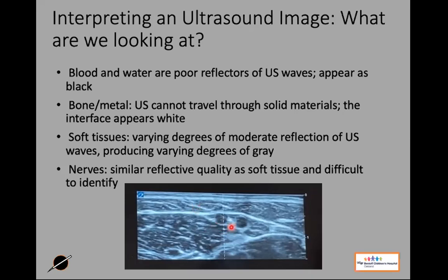And if we see two blood vessels running together, you can see this kind of compartment here. There's kind of a triangular compartment here. That's a great place for that triad that I was talking about earlier, the artery, the vein, and the nerve running alongside each other. So when you see something like this and you're applying some pressure and one's a vein and one's an artery, I want you to avoid this area, okay? Stay away from that. We do not want to hit a nerve.